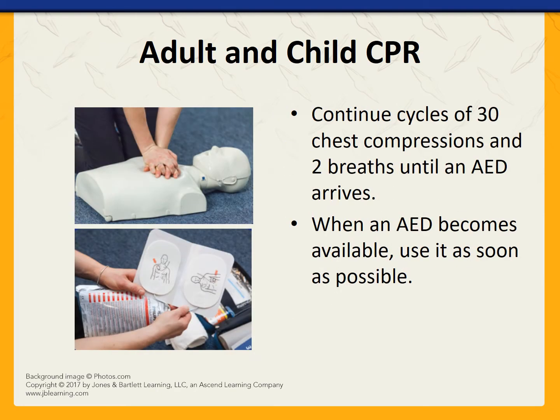Finally, just remember to continue cycles of 30 chest compressions and 2 breaths until an AED arrives and you are able to use it, or EMS comes and relieves you of your job. If an AED arrives on scene, immediately begin to use it and continue with your compressions and breaths until EMS arrives. If while performing CPR your person becomes responsive, you would then roll them into what is called the recovery position.